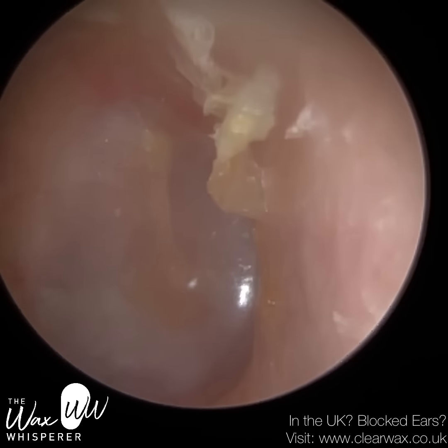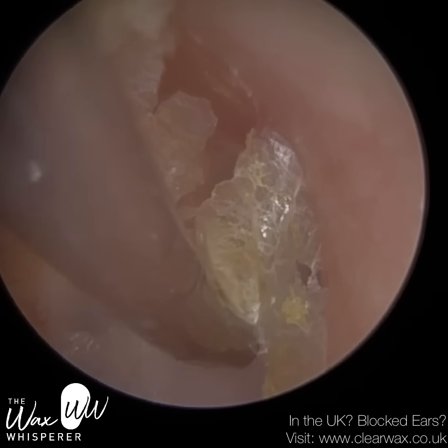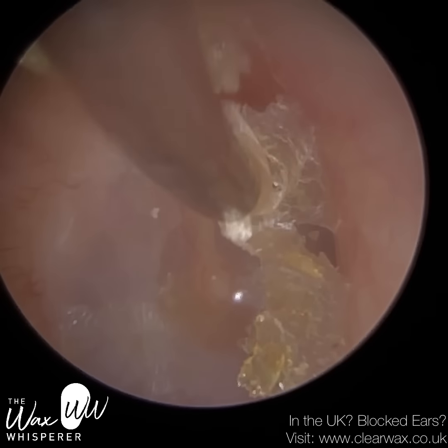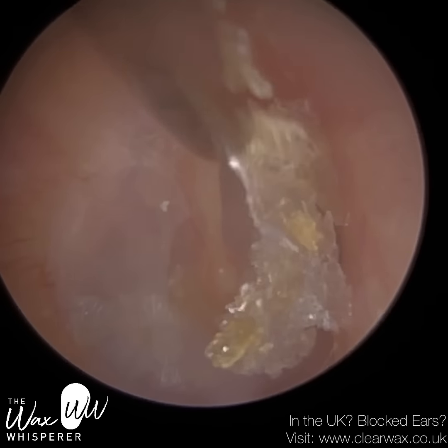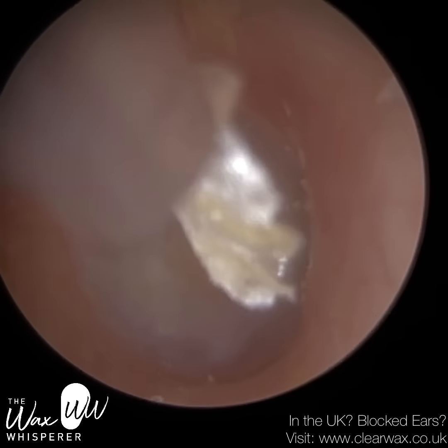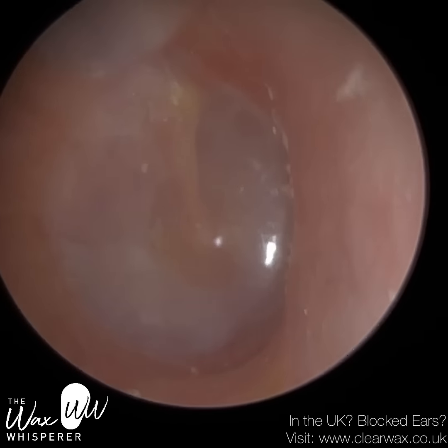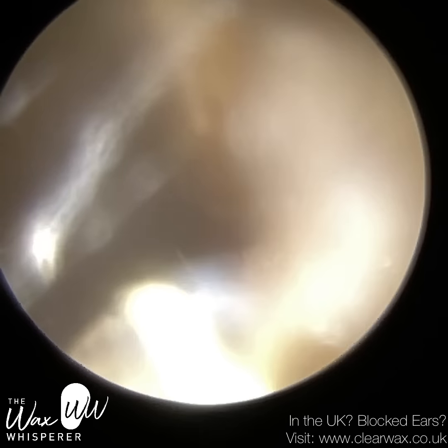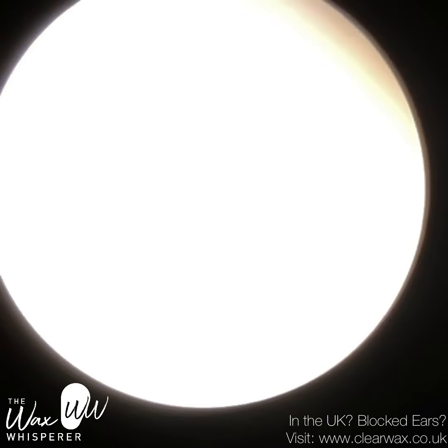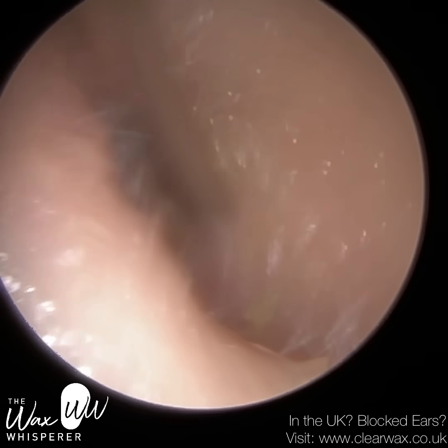So this skin is lining the northern hemisphere. It's from here, but it's lining the bottom here, and also the roof of the ear canal. So in a moment, you'll see me peel away a lot of dead skin. It's almost invisible to the naked eye at the moment, this dead skin at the roof. So you can see I just managed to peel that away. As I'm exiting the ear, I just want to see if there's any debris that I can remove with the sucker whilst exiting.